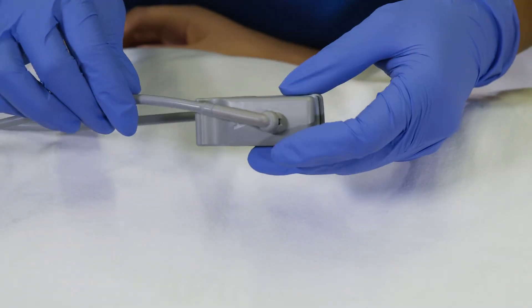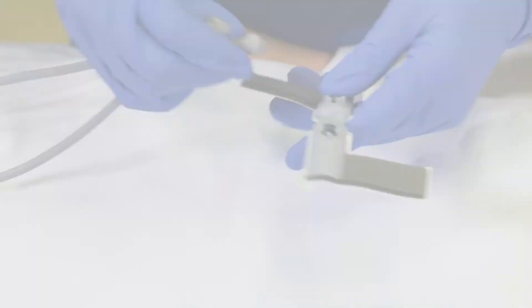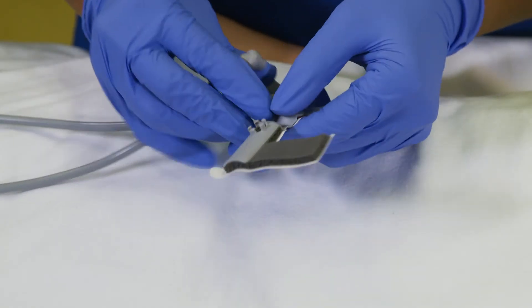To change out the attachments, pull from the hard plastic end and pull straight out. Then you will be able to snap in the attachment you have chosen.